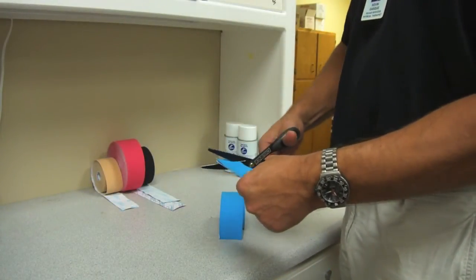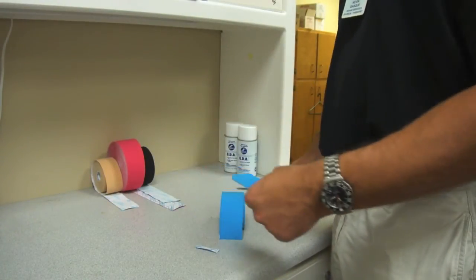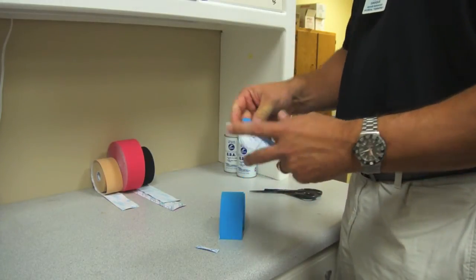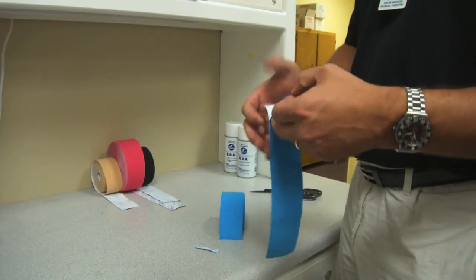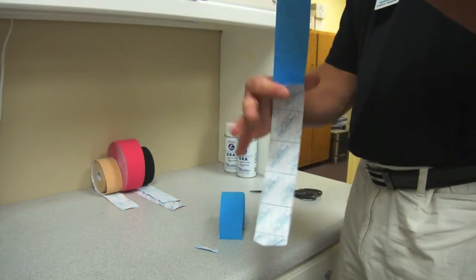As far as the different patterns, the basic rule is if you want to facilitate a muscle, you go from the origin to insertion, or in kinesio taping what they call proximal to distal. If you want to inhibit a muscle, you go the opposite, distal to proximal. You're going against the muscle fibers to give a neurological cue to tell that muscle to relax. And with the swelling part, it actually goes to the lymph channels. So you're taping along the lymph channels and lymph nodes. And the patterns themselves are just up to the therapist and experience. You can get creative with them.